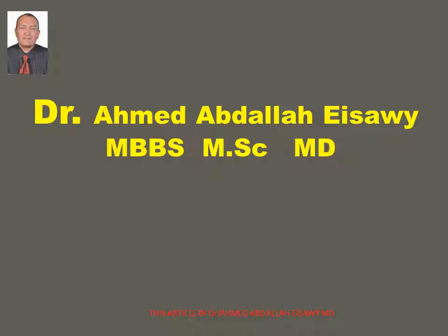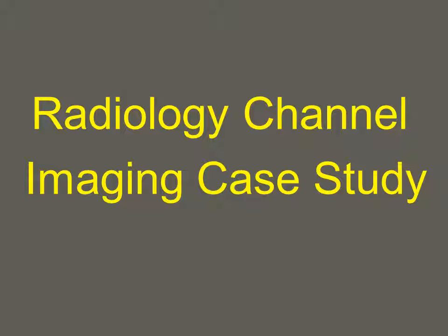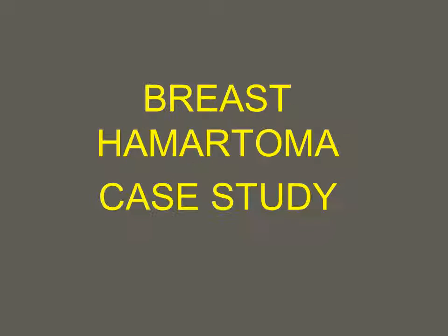Bismillahirrahmanirrahim. Our lectures about case study of breast mass. Radiology channel imaging case study. Breast hamartoma case study.